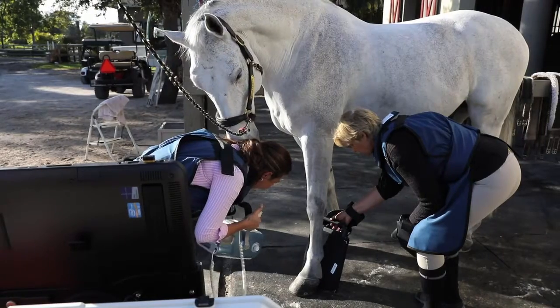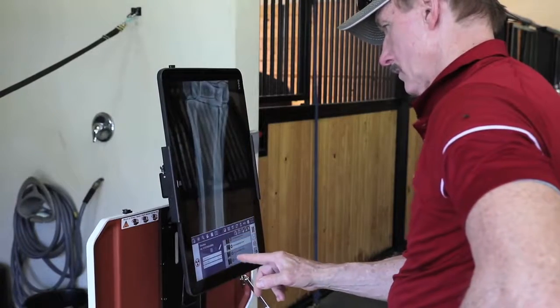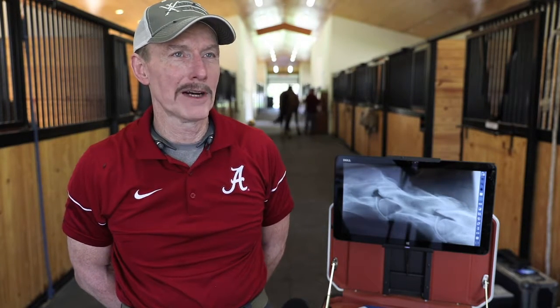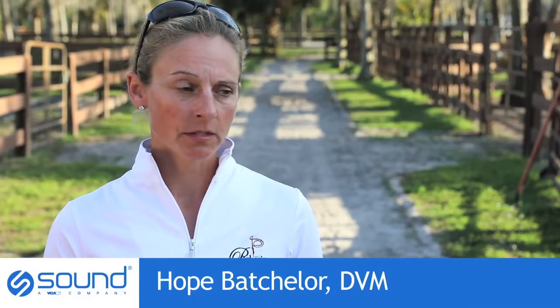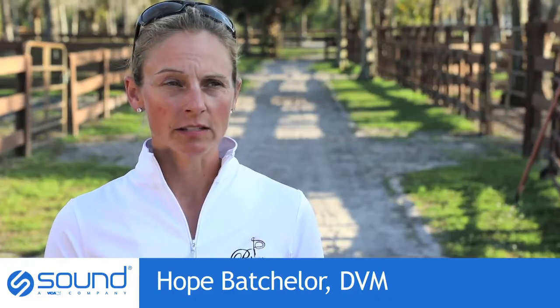I really like the Next because for me, it's really easy to use. It is so simple to use that it's just unbelievable how easy it is to train somebody to take the radiographs who has never been a radiograph technician or a veterinary technician before. We were able to pick it up off the front doorstep, take it to a pre-purchase, and go through and use it for 45 x-rays that same day. I think that speaks to the fact that it's easy to use.